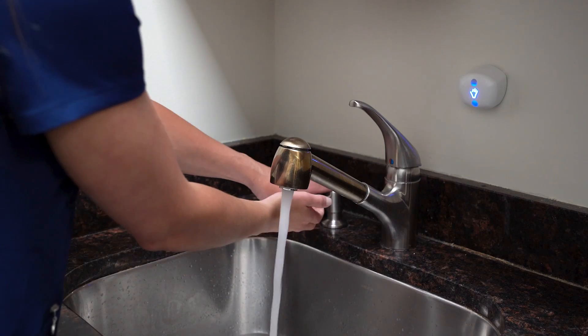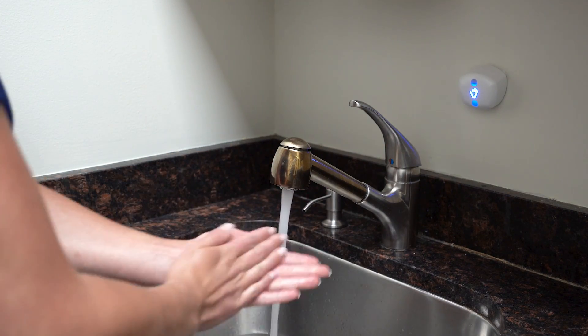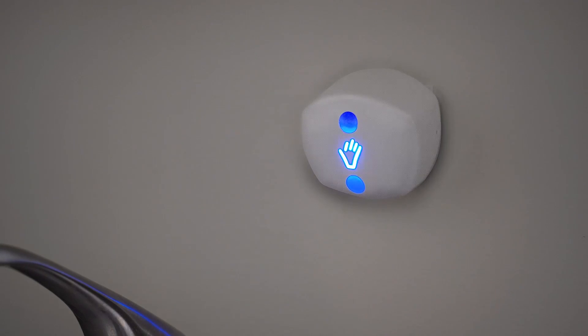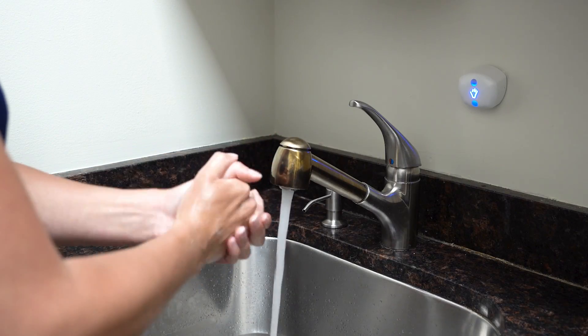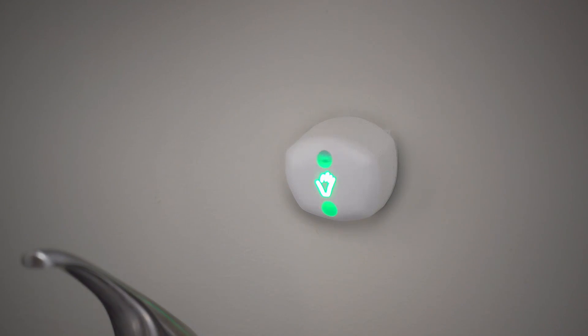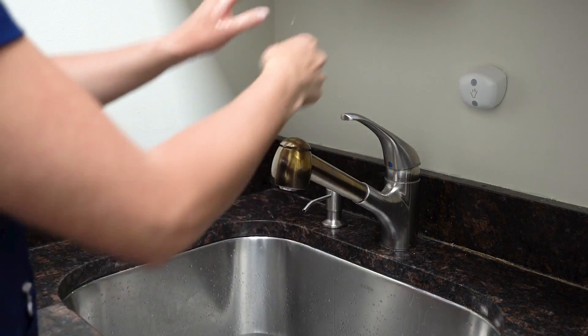As soon as the user breaks the field of the trigger sensor, the light will begin to pulse blue. As the user continues to wash their hands, the blue light in the sink sensor will increase in frequency, pulsing faster and faster until the end of the 20-second session, when the light will turn green, indicating to the user that the 20 seconds is over and their hand wash is complete.